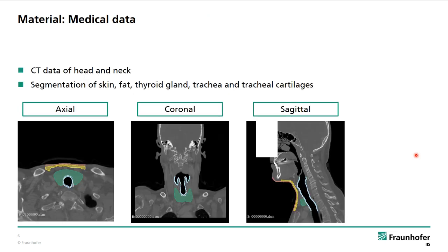We have 3D CT data of the head and neck, segmented using 3D Slicer. Here you can see in brown the skin, in yellow the fat, in green the thyroid gland, in blue the trachea, and in lighter green the tracheal cartilages.